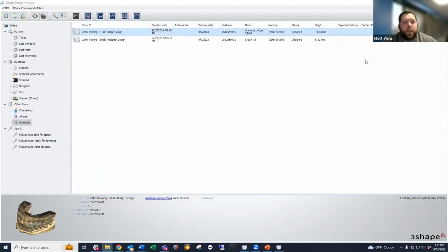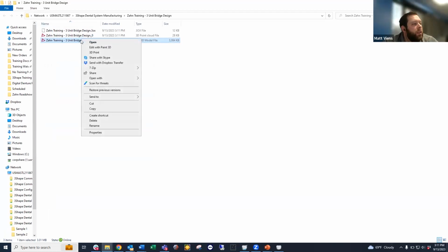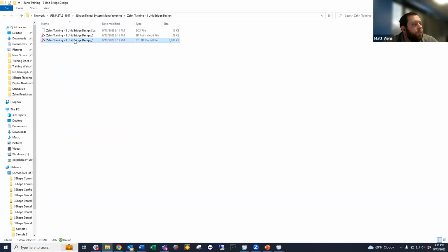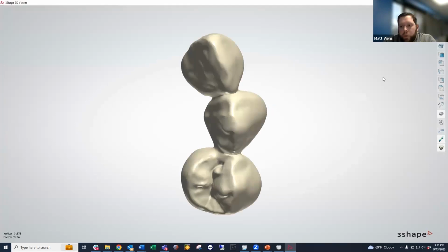I'm just opening up the design using Shift F4 when in the Dental Manager. So I can see my STL file that I have here. If I bring that into the 3D viewer, that's a similar tool that we have available to us. There's this option here that's called the 2D cross-section tool, and this is an option that is available to us during design as well.